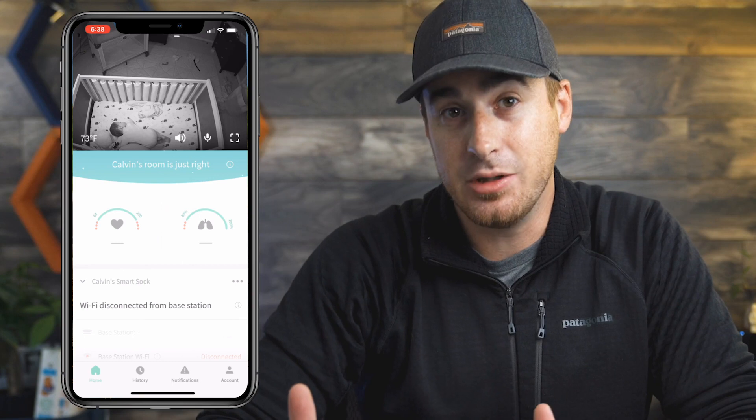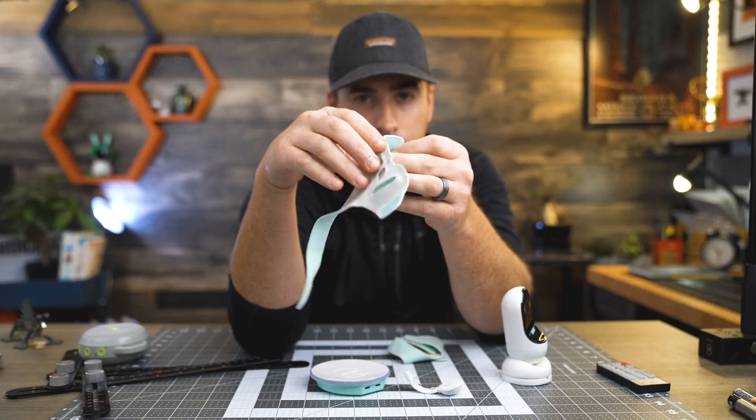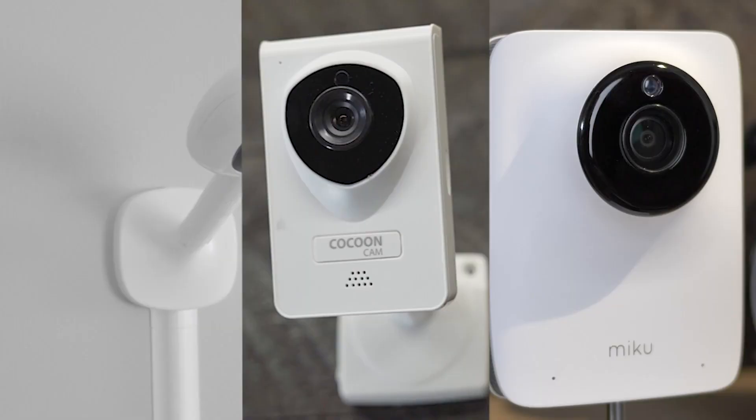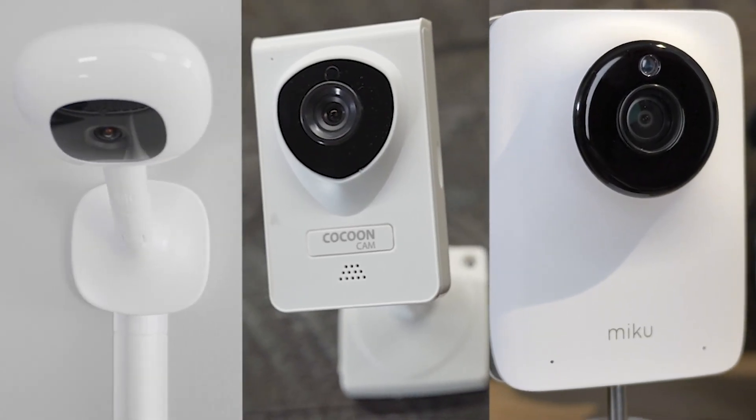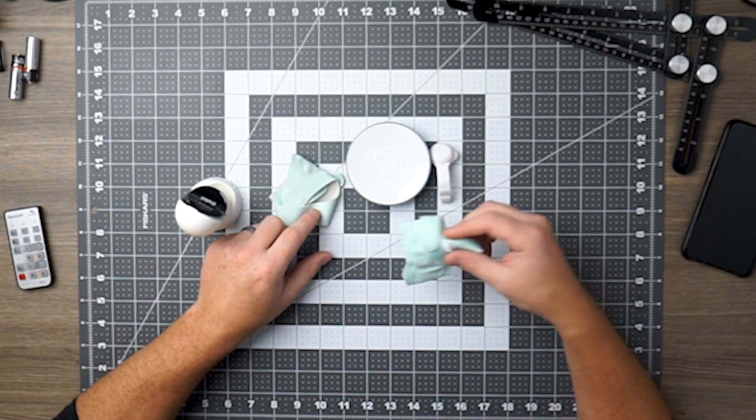In my opinion, the Owlet camera has the best picture quality out of any video monitor we've reviewed — and we've reviewed a lot. That said, here are some caveats. For anyone looking for a video monitor, the only way this camera provides real value is by bundling it with the sock. The camera alone is a dumb camera. Monitors like the Nano Plus, Cocoon Cam, and Miku Baby Monitor house the heavy-duty tech within the camera itself, making them smart — all analytics and data recording happen within the camera. Without the sock, you're left with a pretty standard camera.